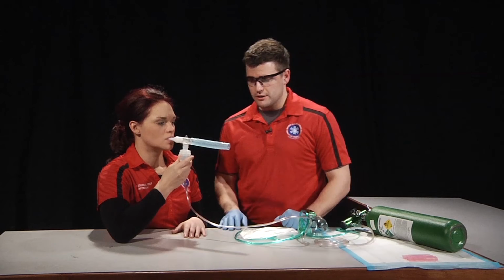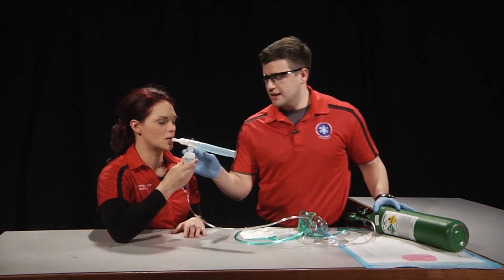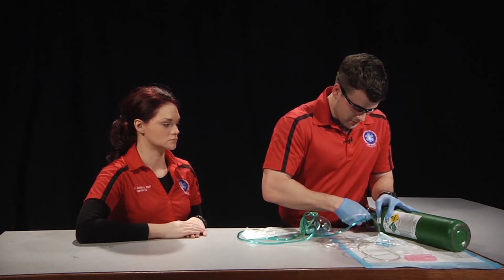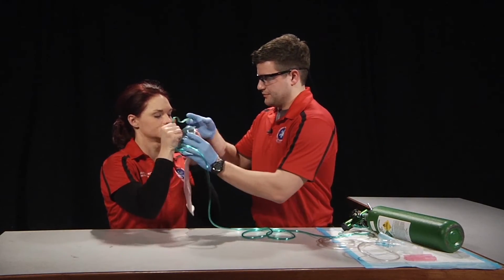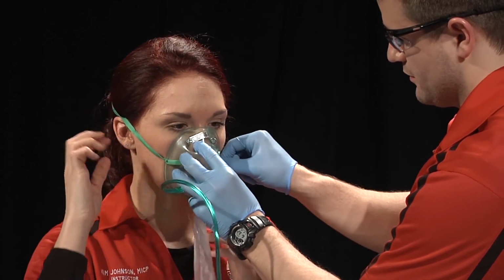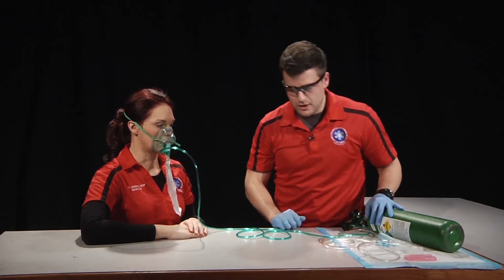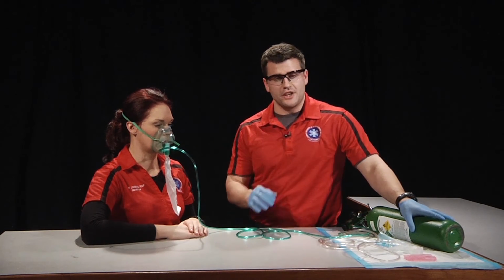Once the medication's gone, we'll go ahead and discontinue the oxygen, take the nebulizer from them, disconnect the nebulizer and reconnect our non-rebreather, and assist our patient in putting the non-rebreather back on. Turn the oxygen back on to the appropriate setting, and we're now going to monitor our patient for the desired and adverse effects of the medication that we administered.